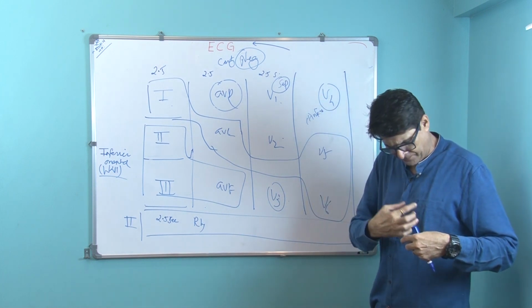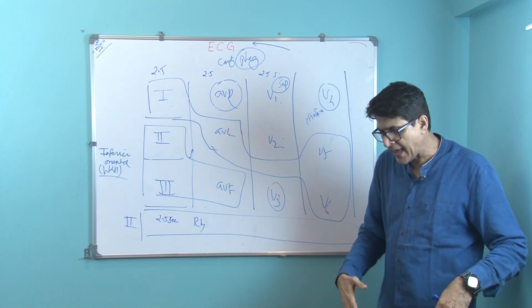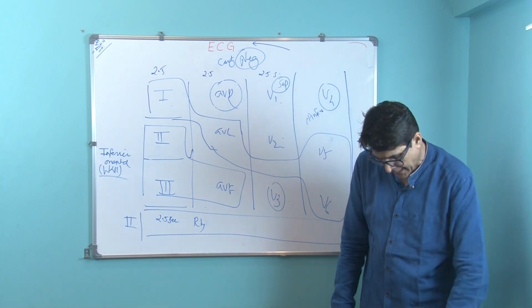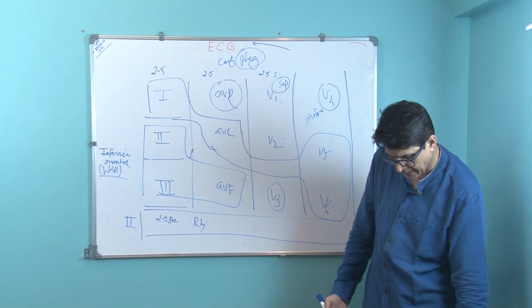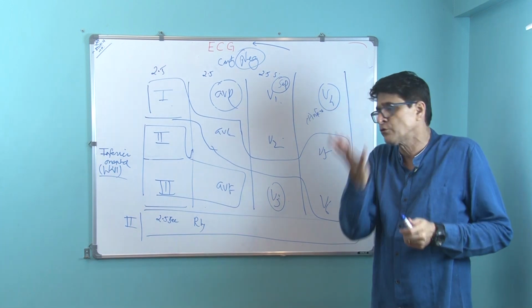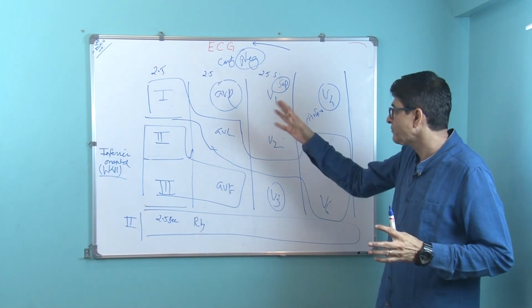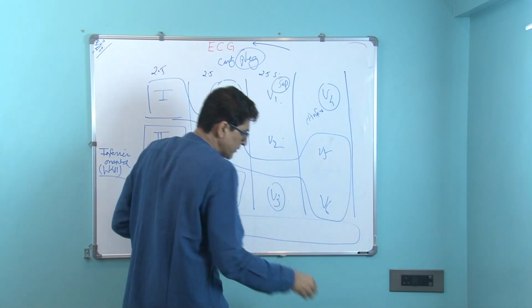V1, V2 septum, anterior, lateral, 2, 3, AVF. See, how the leads are connected from this to this. AVF is down, so its camera position is down. So they are looking at the inferior portion of the heart, the inferior wall, because you have to cover from all the angles. That is why there are so many leads. I will explain again how this works.